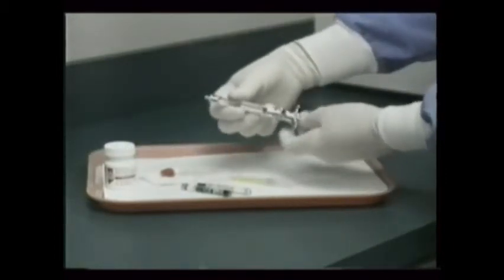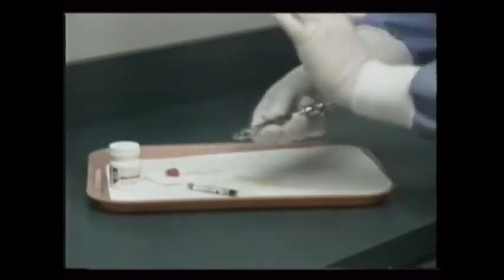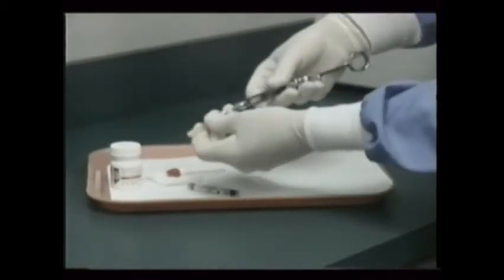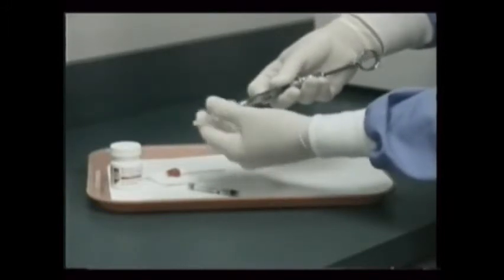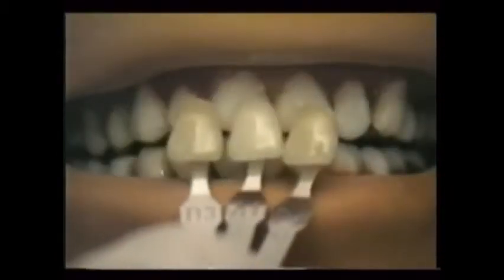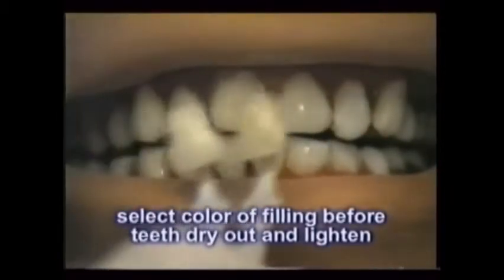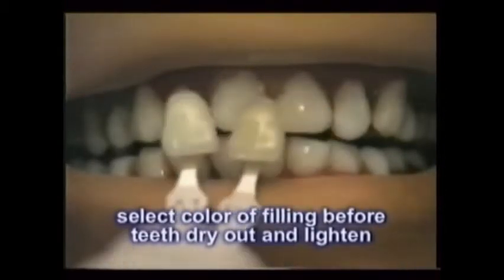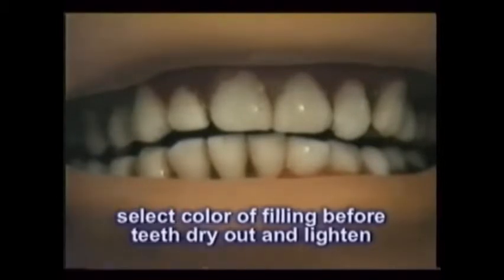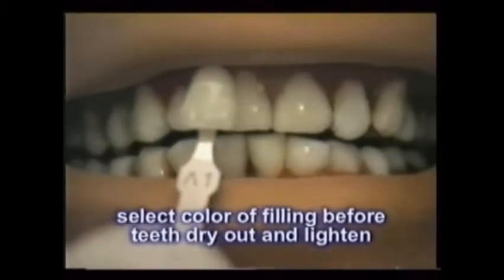Composite restorations require using many of the same instruments as in placing amalgams — naturally the basic setup and any items needed for anesthesia. Before the procedure even begins, a shade guide is used to decide the color of the materials that will be used in the filling. If you decide to use a shade guide later, the teeth may have dried somewhat and taken on a lighter shade, so do this first.